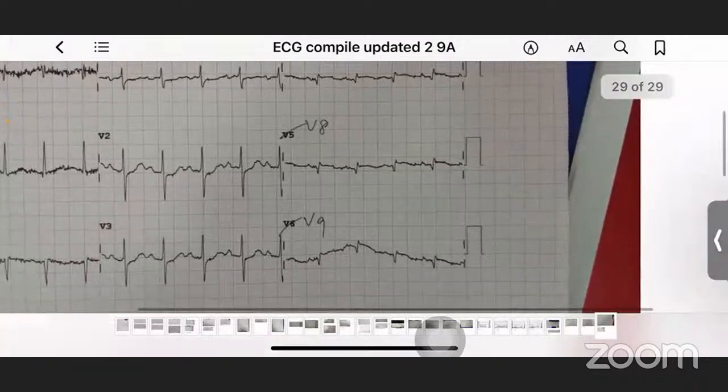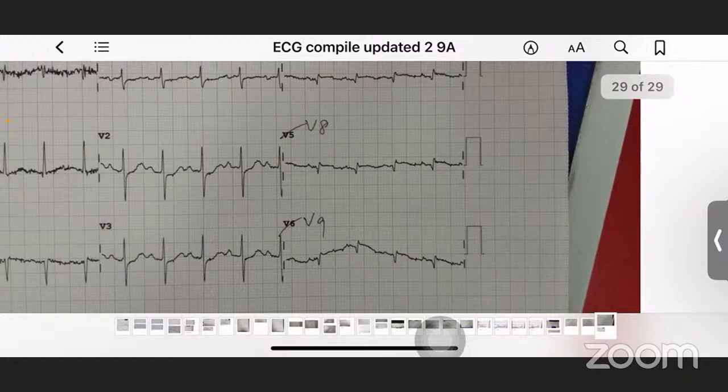Okay, so just now we covered 5W1H. This 1H includes not only how to interpret, but also how to do the ECG. Where do you place the leads? I let you revise where you place the leads. V4 is in the mid clavicular line. So you take the clavicle, then V4, anterior, mid clavicular. V5 is in the anterior axillary line, and then V6 is the mid axillary line.